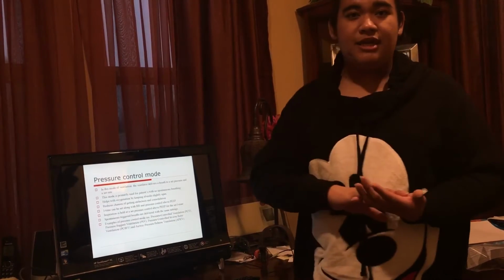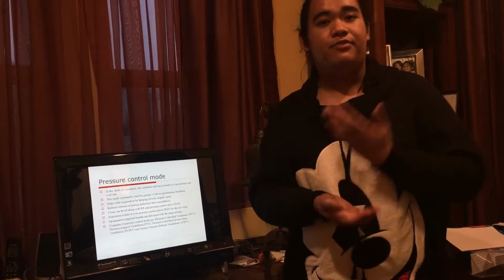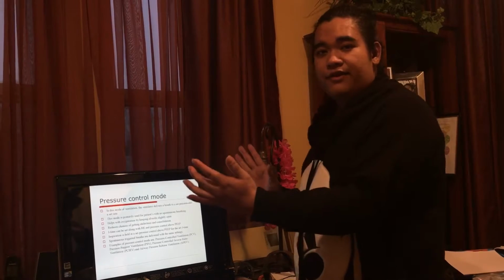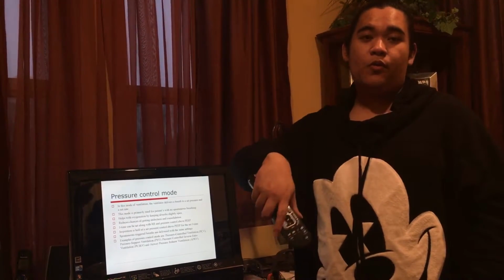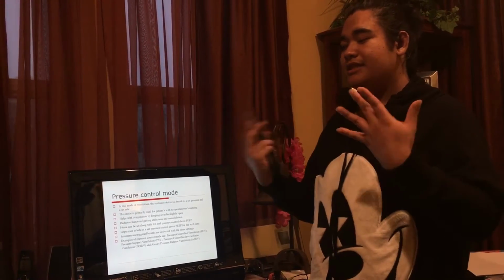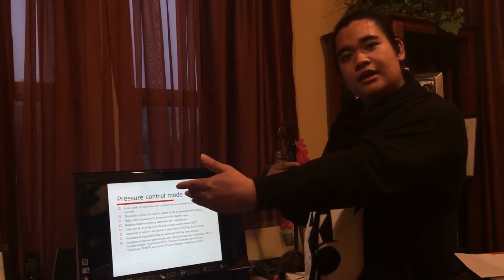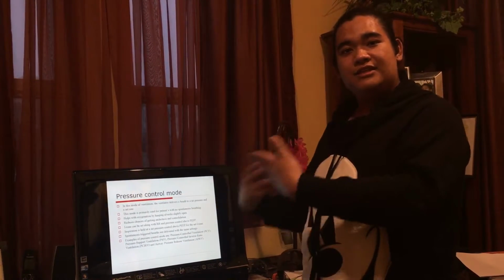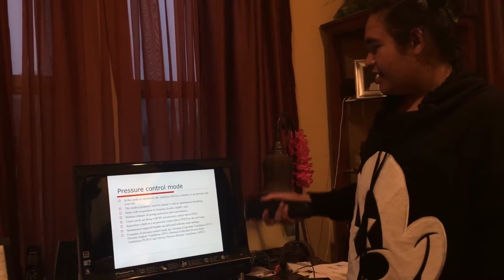Now, when the patient is awake and all of a sudden starts spontaneously breathing, all of those settings will carry over once the patient is awake. So when the patient is sedated and awake, none of those settings are going to change. Everything is going to be kept. So that's what it's saying in there.